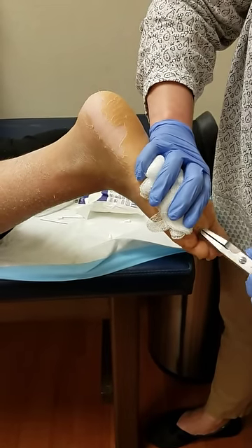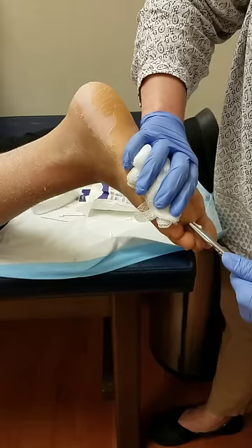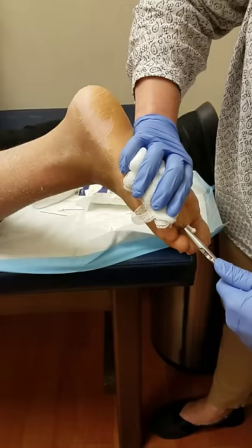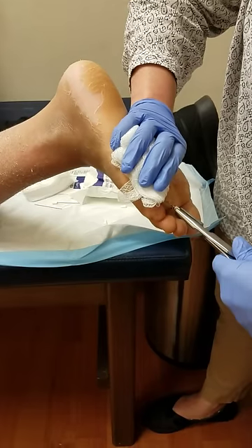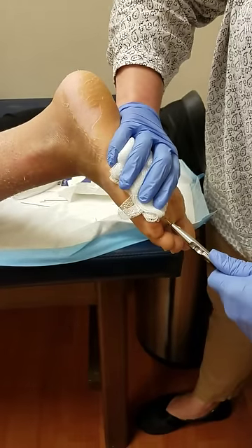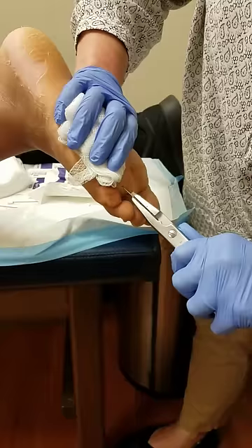It's okay. Just think about the fact that you're going to get to swim. This one's a little bit more. Hold on. Almost done. I can feel it trying to loosen up. Just give it a second, baby. It's coming. We're getting there. I'm sorry. It's coming out, baby. Just bear with it. It's coming. Keep on breathing.